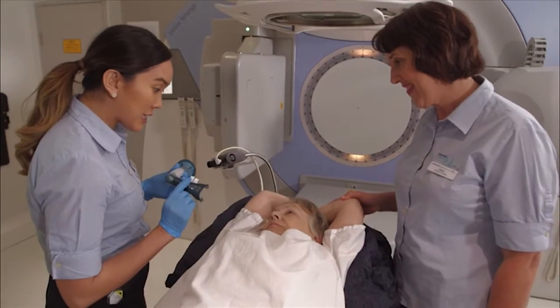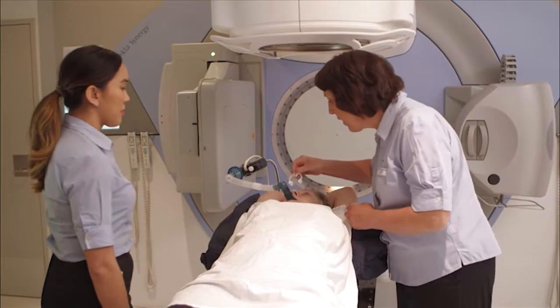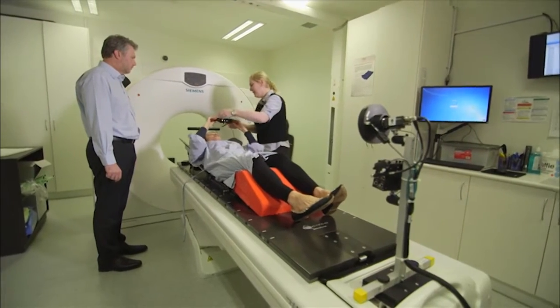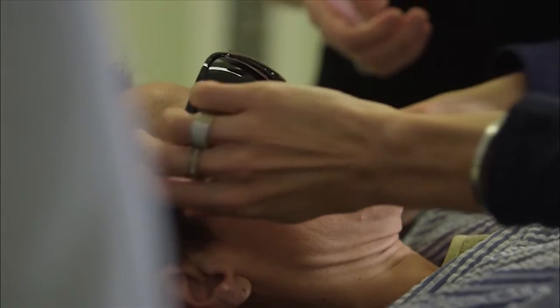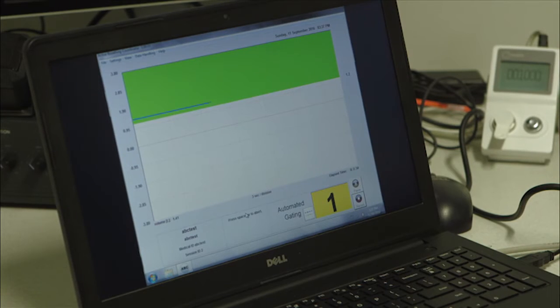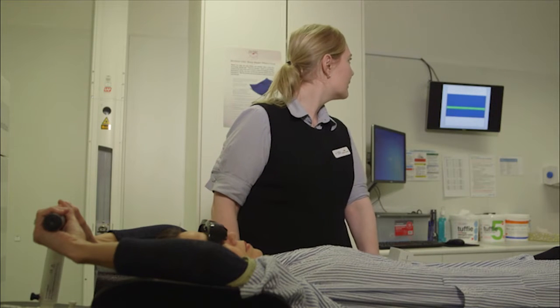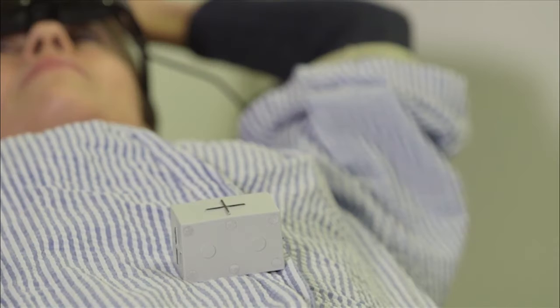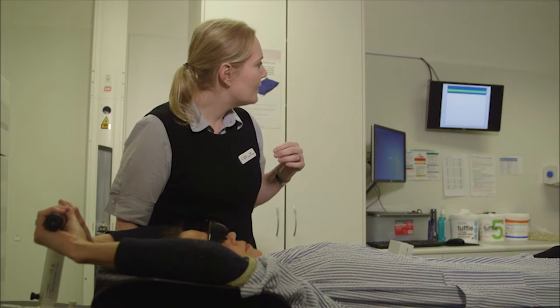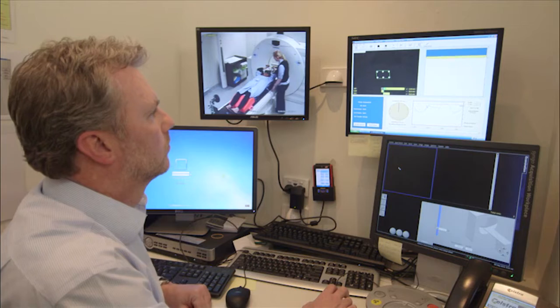If using the snorkel method, the scan is performed while you use a breathing mouthpiece, which will stop the flow of air when your lungs reach capacity. Alternatively, you may wear a pair of video goggles, which guide you through graphics about when to hold your breath. Both the snorkel and the goggles allow your radiation therapist to see your breathing pattern. You are in control at all times and able to monitor your breathing. Our team will practice the breathing technique with you at the CT planning scan to make sure you're comfortable before going ahead with the scan.